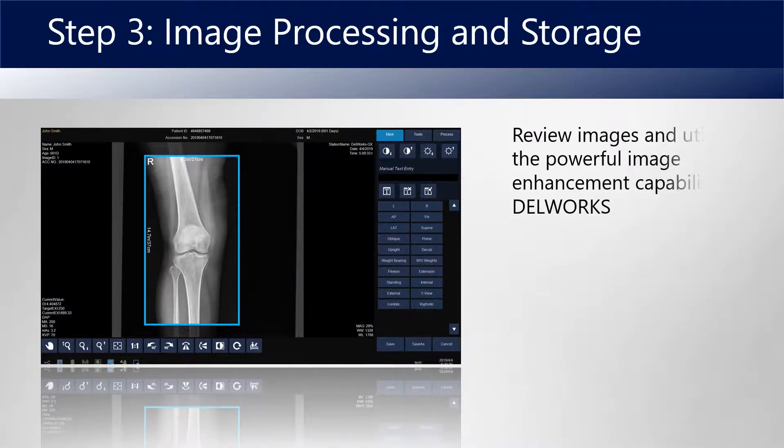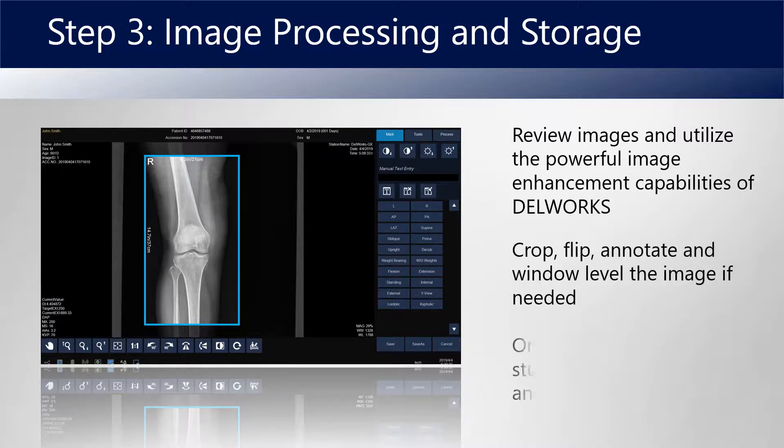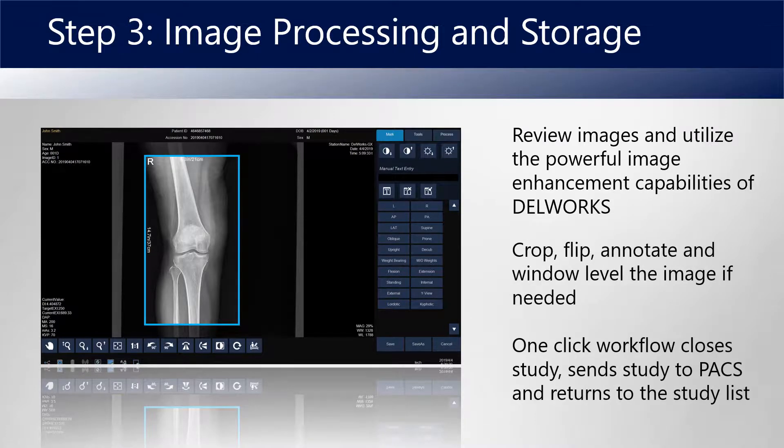Finally, review your image, add a marker or crop or flip the image, and then with one click send the study to PACS to return to the patient list.